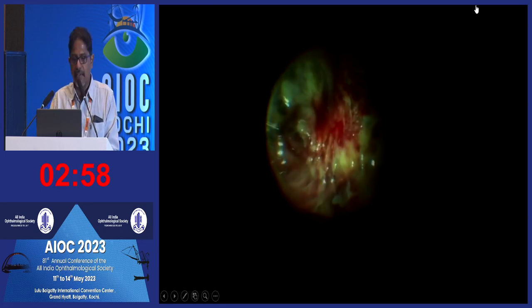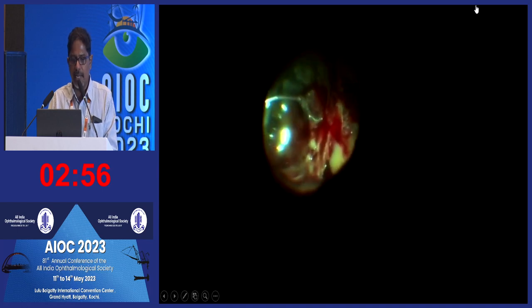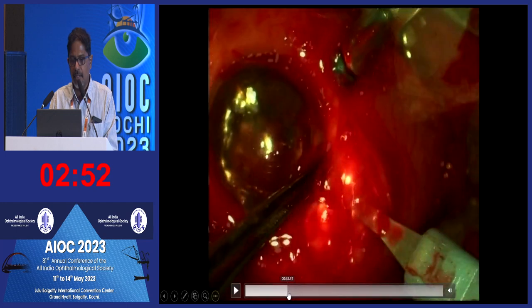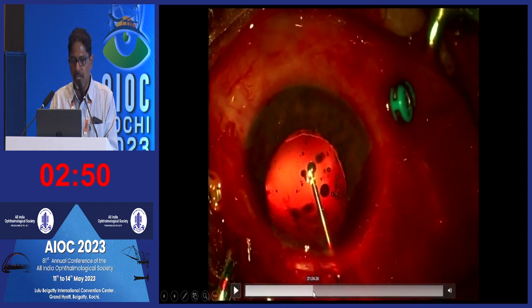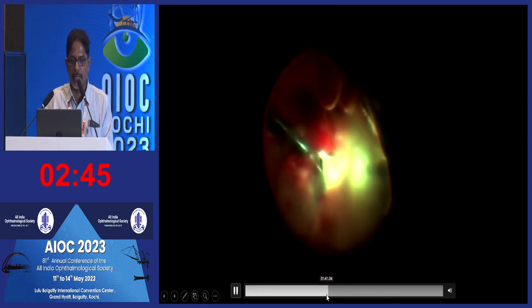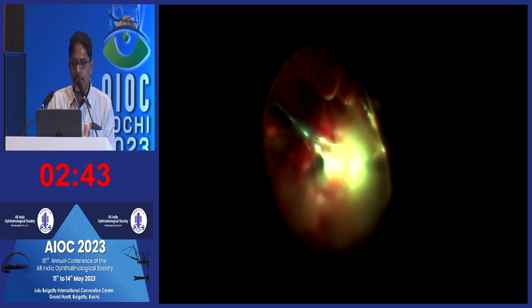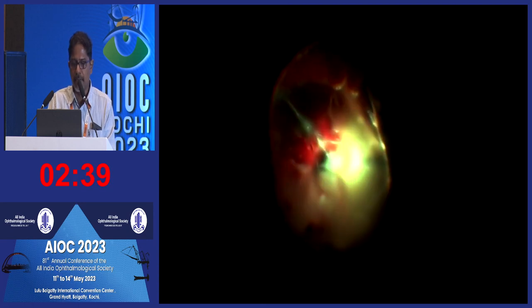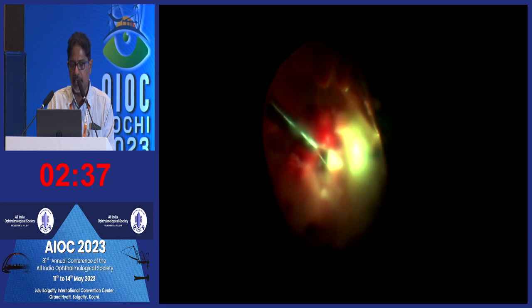You can see the very heavy foreign body with a lot of bleeding and significant exudation in the vitreous cavity. The same technique we are using here. I'm putting in oil to fill up the vitreous cavity. Now this is the Bapai claw forceps, and the oil was keeping the blood from mingling into the vitreous cavity and causing loss of clarity.